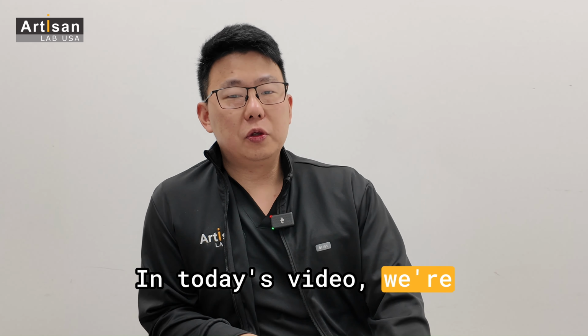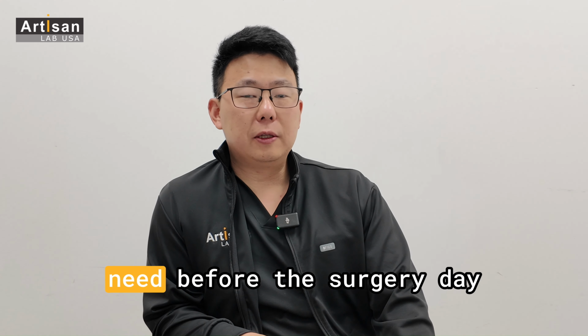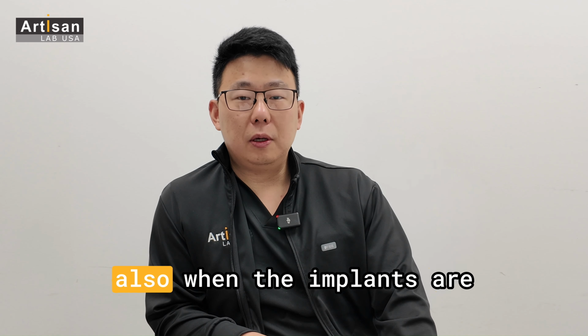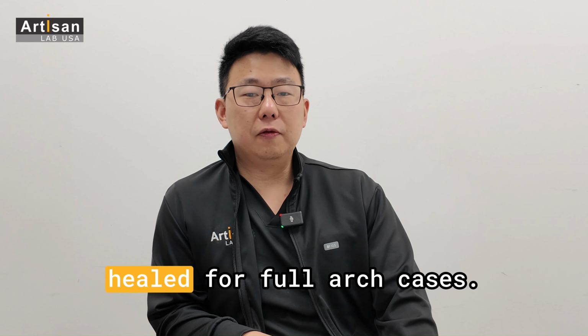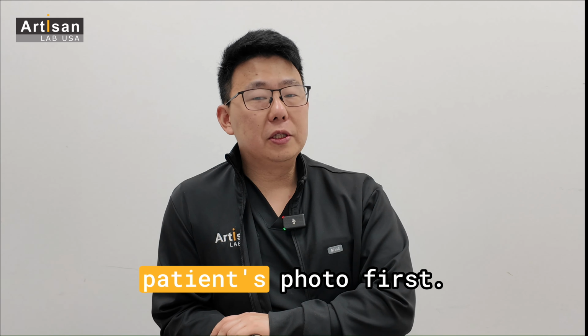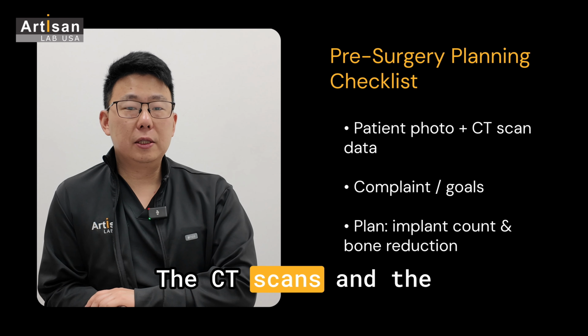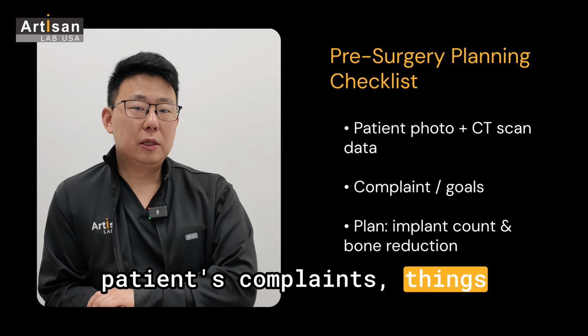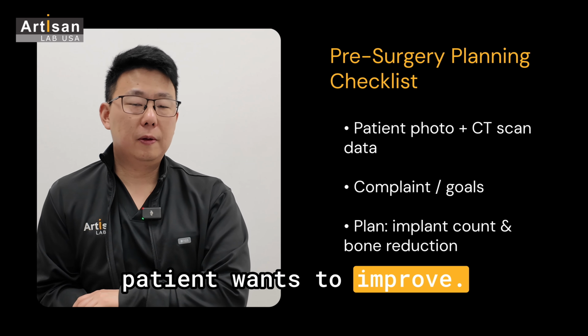In today's video, we're going to review what we need before the surgery day and on the surgery day, and also when the implants are healed for full arch cases. We need mainly the patient's photo first, the CT scans, and the patient's complaints, things the patient wants to improve.